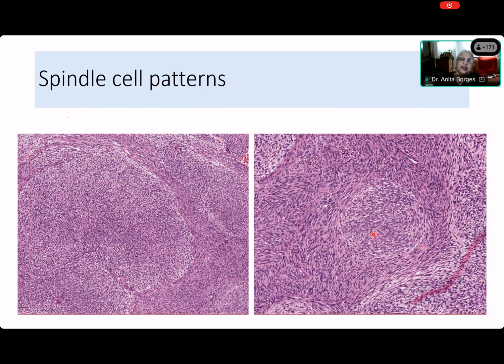So they're transversely cut. Now in your mind, you should understand that these are all fascicles. Yes, they are all fascicles, but in this particular slide, you are seeing some fascicles that are cut longitudinally, some are cut obliquely, and some are cut transversely. So what kind of pattern is this, do you think, Priyamada? All the rest, I hope you're thinking. Deepali? Mixed type. Yes, mixed type. Not bad. Come on, Deepali. Sheath, ma'am. Sheaths. Absolutely right.